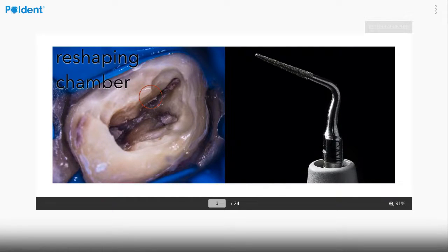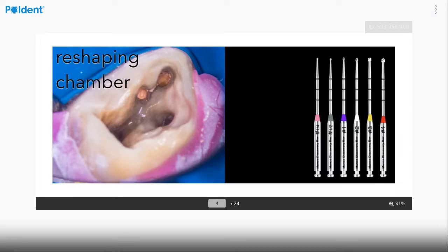Mark showed you some different tips for post removal, for removing the gutta percha. There are many tips that we can choose, so I believe everyone will choose something for his own practice. Personally, I like diamond coated with the shape that you can see. There are many manufacturers, many types are available, but the diamond coating gives us very good work, very fast and very efficient.